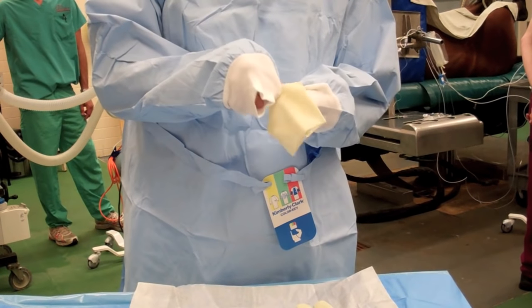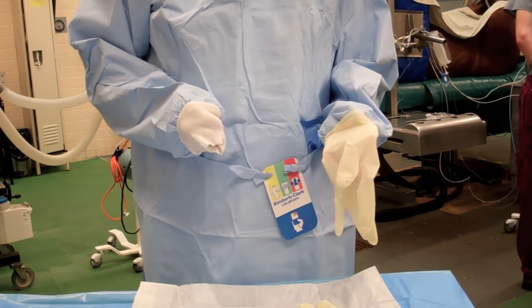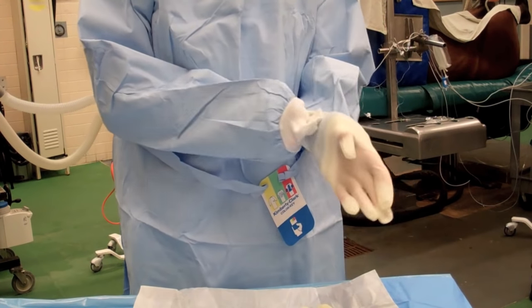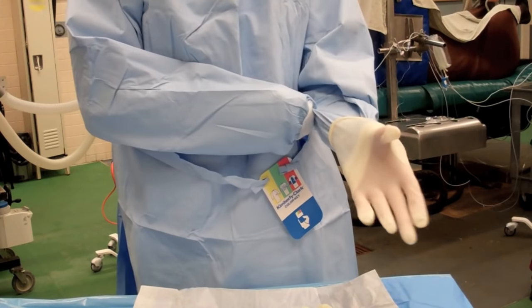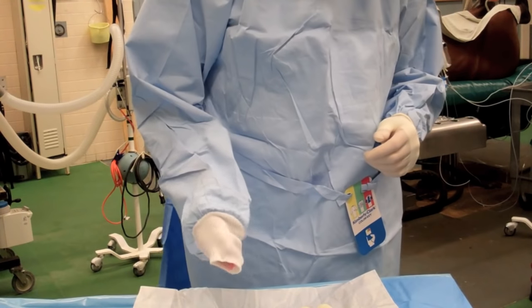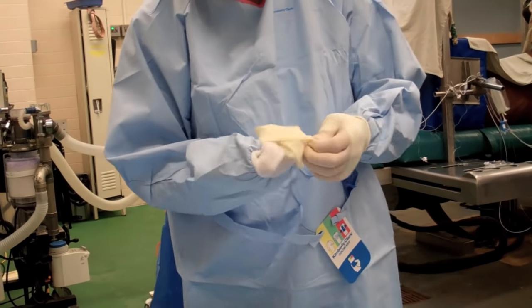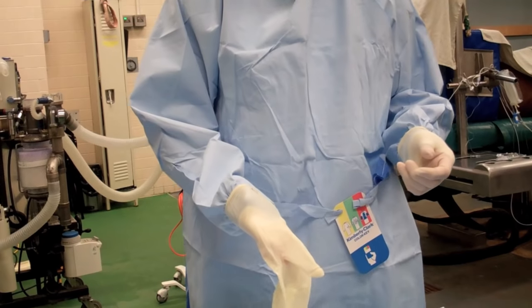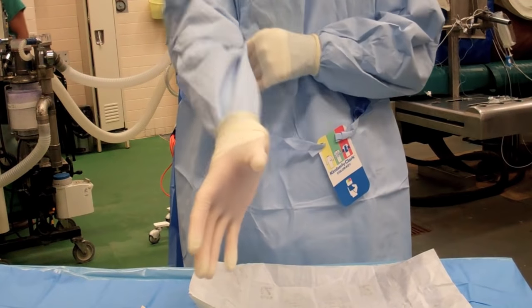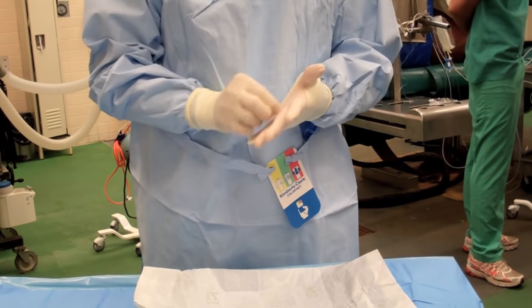What I'm going to do now is, without touching the glove with my hand, roll that cuff over and completely enclose the cuff part of my gown. Then I'm going to sneak my hand into that glove, just like that. I can do the same thing on the other side — grab that thumb, because it's already thumb to thumb, flip it over, and completely encircle the cuff. Now I'm ready to adjust my glove.